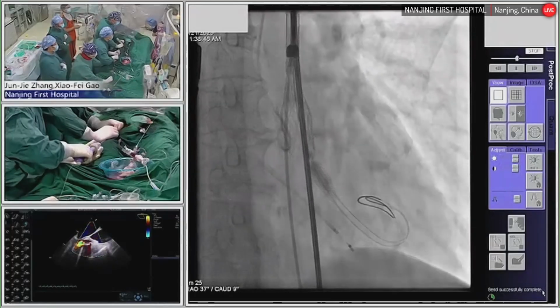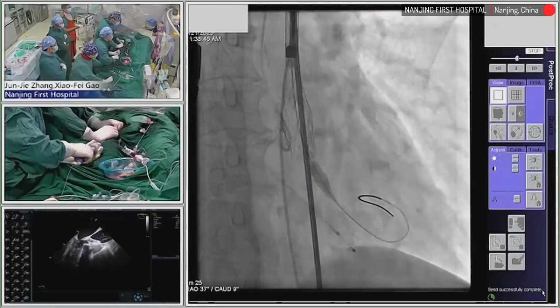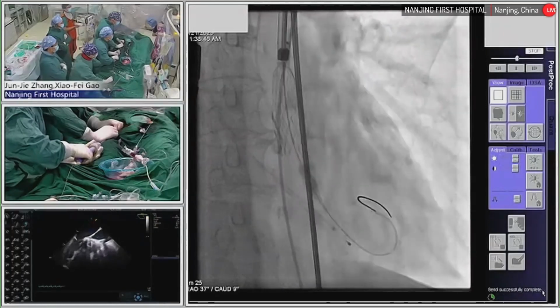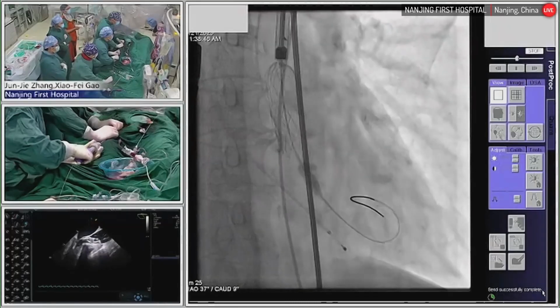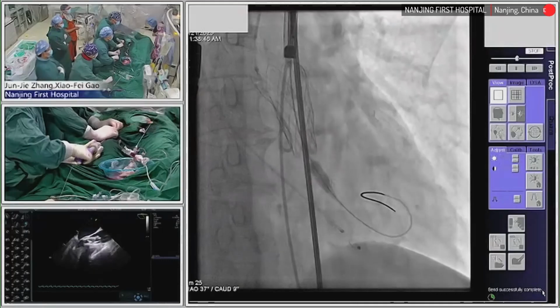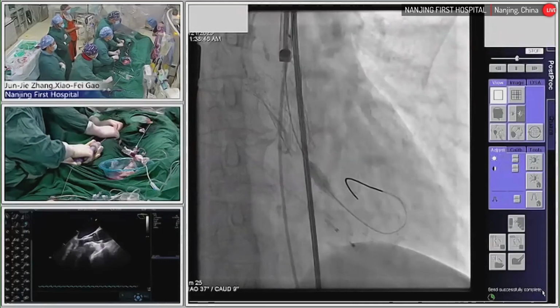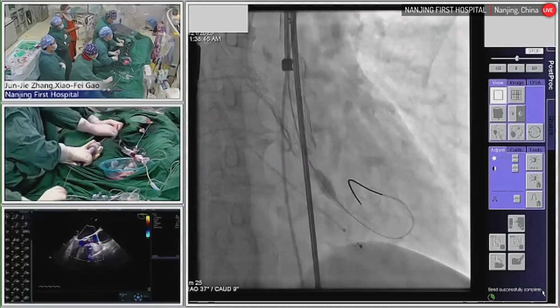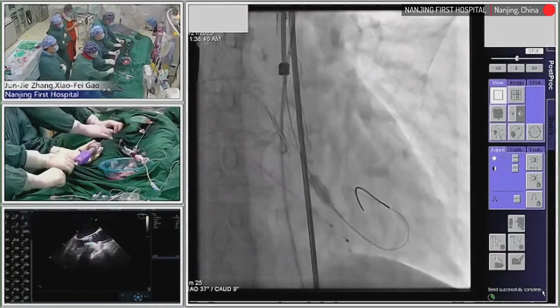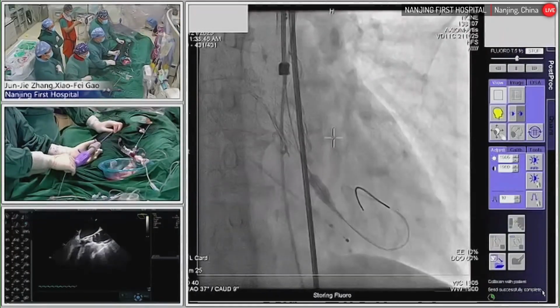The position is good. Yes. What's the dips? 0 dips. 0? Yes. Not sure. 还没放完会好点，小心点，不能再顶了。不顶。Okay, good. Yes. Okay. Looks good. Very stable. We stop pacing.